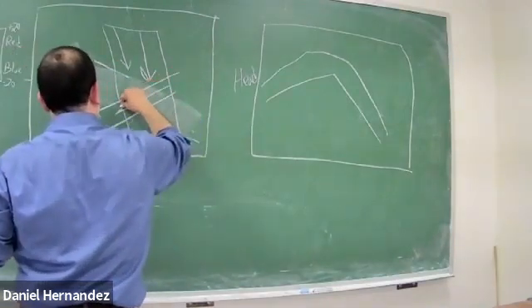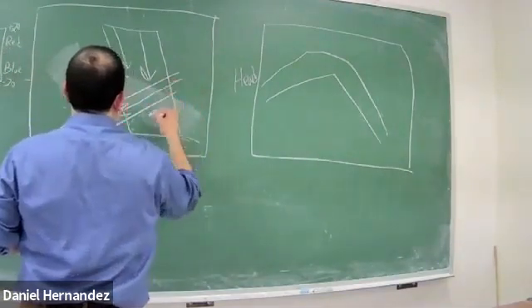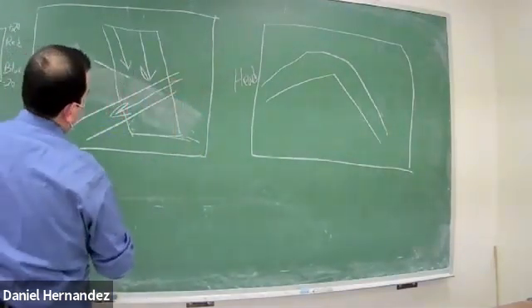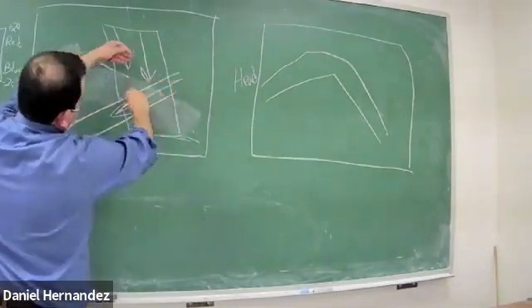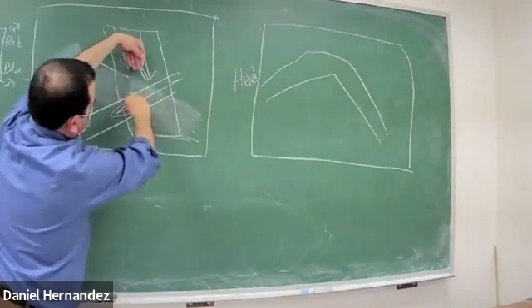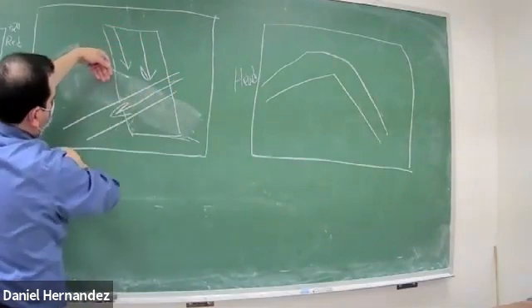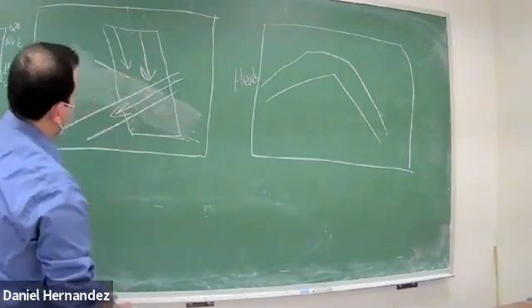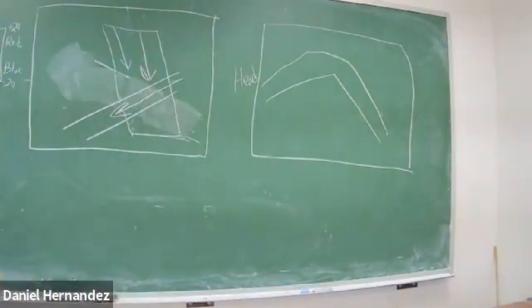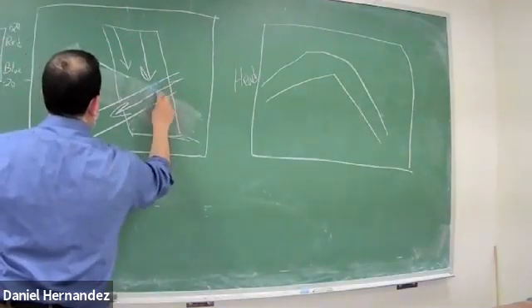But now instead of coming towards the ultrasound beam, that blood flow is running away. My beam is coming down this way, but the blood flow is headed away from it. So that creates a negative Doppler shift, and this segment would appear as blue.